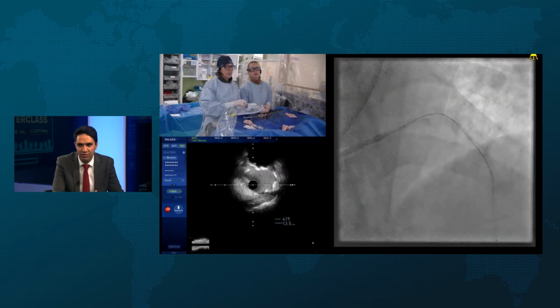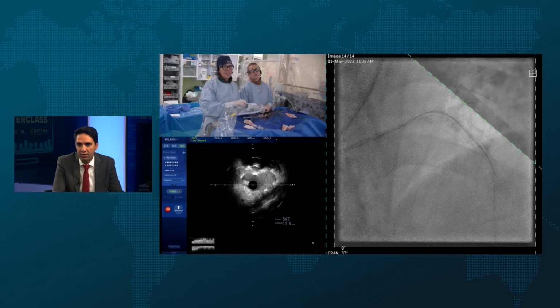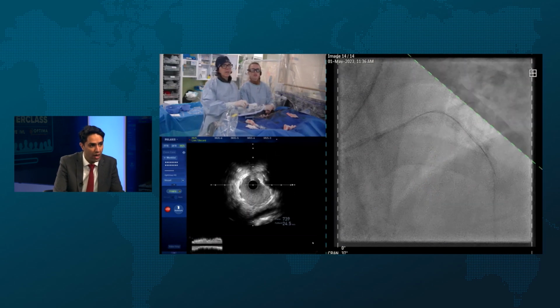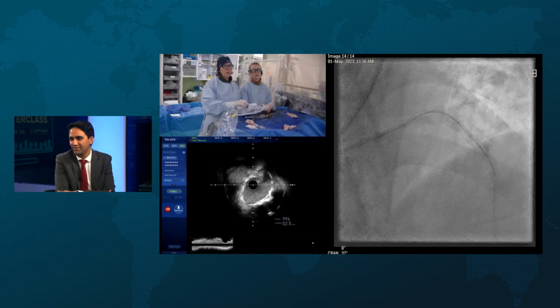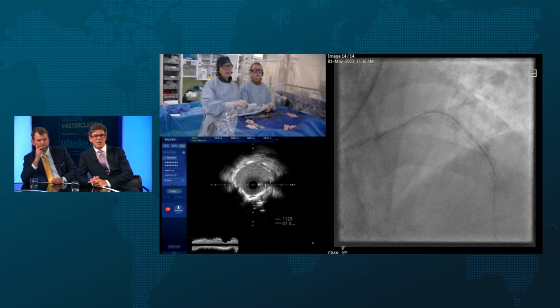I'm not surprised you're saying that. But the main feature is it does allow you to differentiate between eruptive nodule and protruding nodule, which actually has some clinical implication. And the second thing is it's just so easy to see the fractures. Yeah, absolutely, no doubt about that. But having said that, with this HDI IVUS, it's been beautiful imaging. We've seen what we need to see.